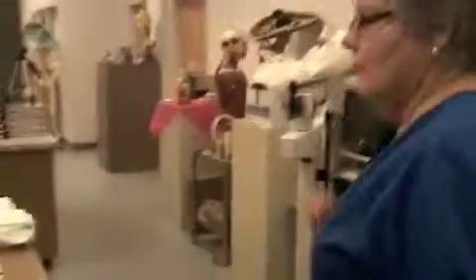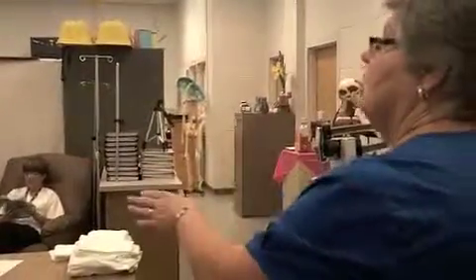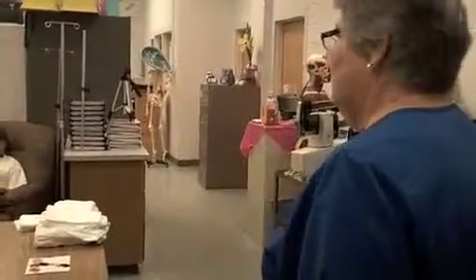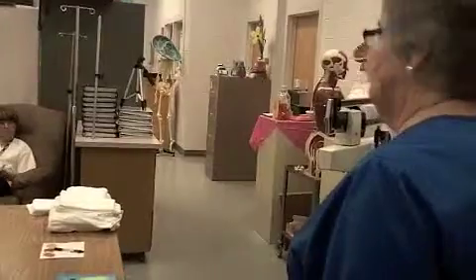Okay, any questions on that one? Do they have to zero it out after they've recorded? No, ma'am. Actually, tell them not to. Then if they forget, they can come back and look at it again, and it gives the evaluator a chance to come back and look at it again. So just tell them to leave it.